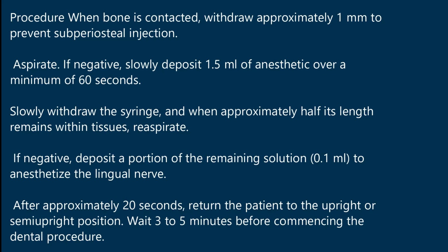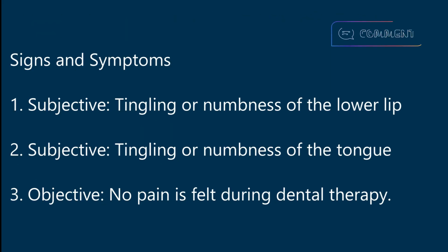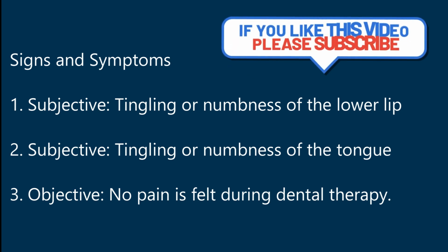After approximately 20 seconds, return the patient to the upright or semi-upright position. Wait 3 to 5 minutes before commencing the dental procedure. Signs and symptoms. 1. Subjective. Tingling or numbness of the lower lip. 2. Subjective. Tingling or numbness of the tongue. 3. Objective. No pain is felt during dental therapy.